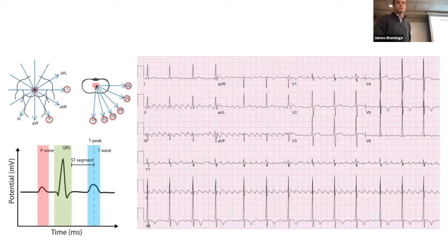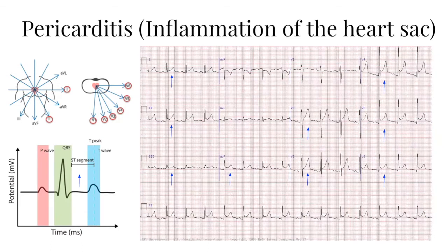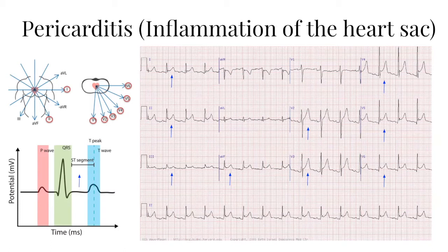So here's another example of, you know. So James, can I ask you a question? Yeah. In all these things, you're showing a bunch of different leads, which I think are different readings. Are those over each of three heartbeats, it looks like? Is that the same patient over the same time period, but measured from different angles? You can see in a couple of them that there's something going on, but others look maybe normal. Is that the right interpretation?